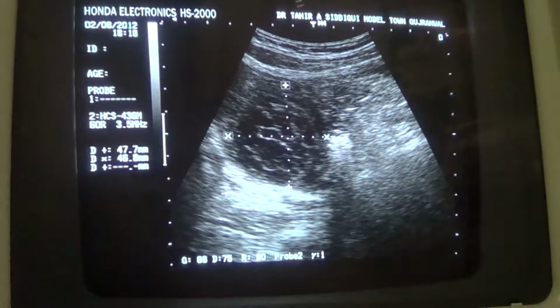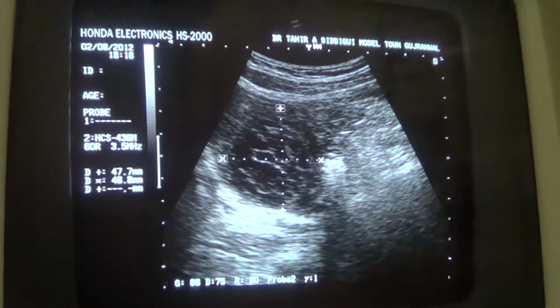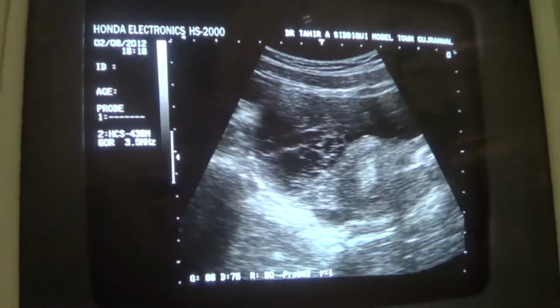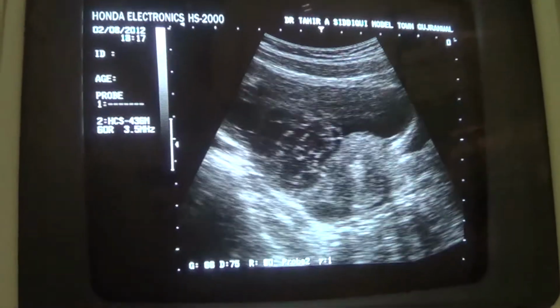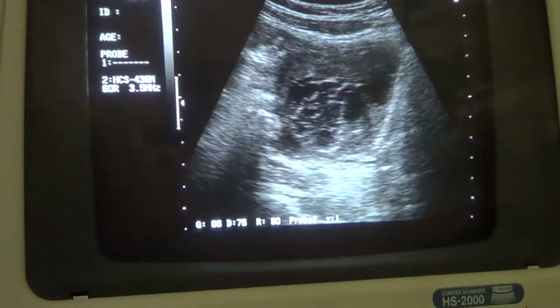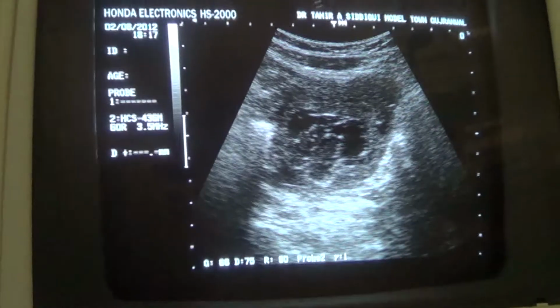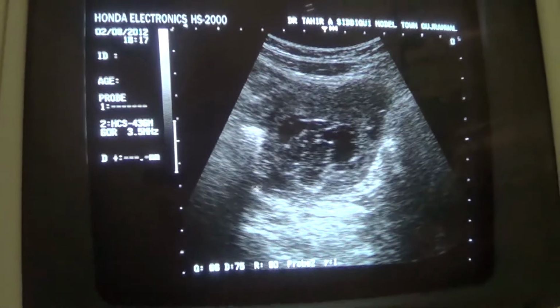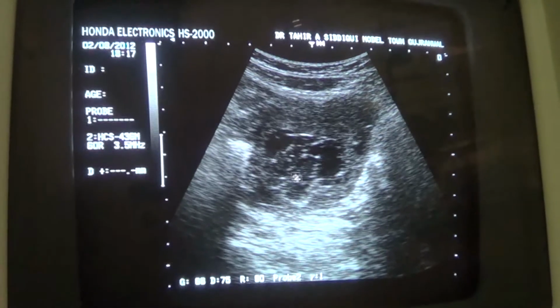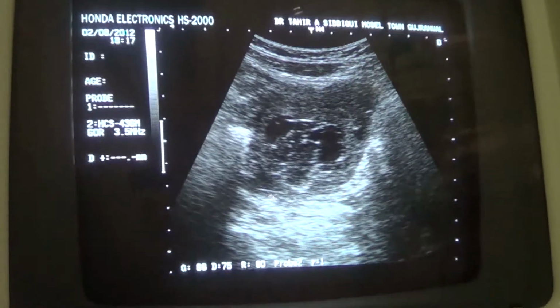Now, why is it cystic? Because you see posterior wall acoustic enhancement. Now, does this cystic area change its shape when I rotate the probe more than 90 degrees? You can see that the cyst retains its size, shape, and posterior acoustic enhancement. The bright area you are seeing is the posterior acoustic enhancement from the complicated cystic area with septa, the thin thread-like structures are the septa.